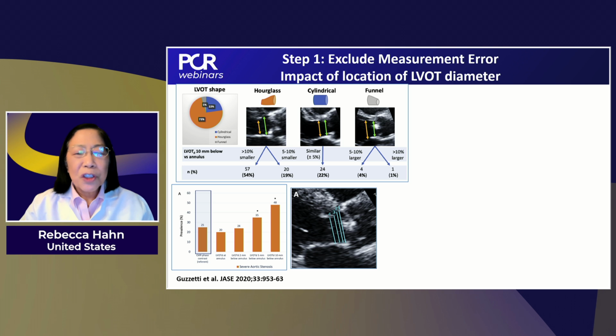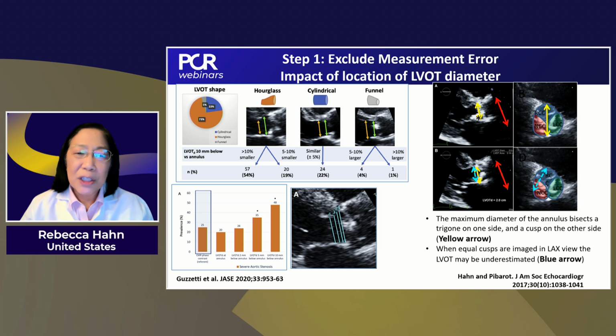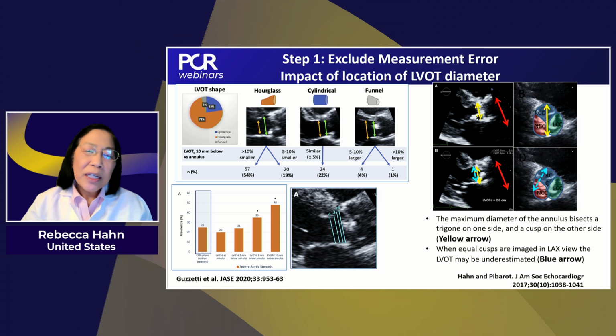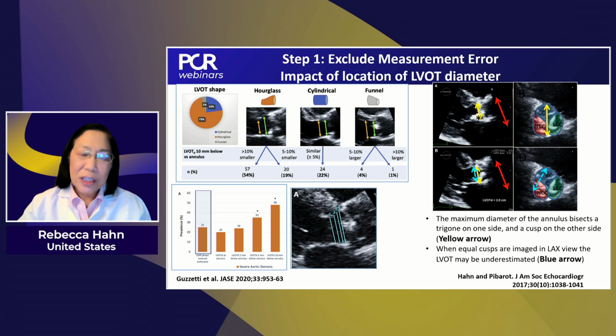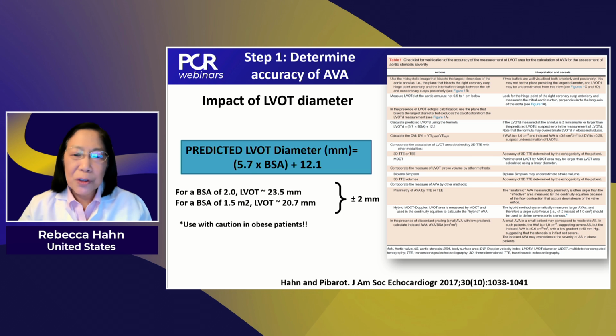And the guidelines, unfortunately, have suggested that we should measure the annular area or the LV outflow tract area using a single dimension, 0.5 to 1 centimeter below the annulus. But we know that that actually is going to underestimate the valve area. And indeed, what the majority of us now use is the actual annular measurement. So don't go into the region where you have a septal bulge that will narrow down the LV outflow tract and artificially give you a smaller valve area, but instead use the annular area.